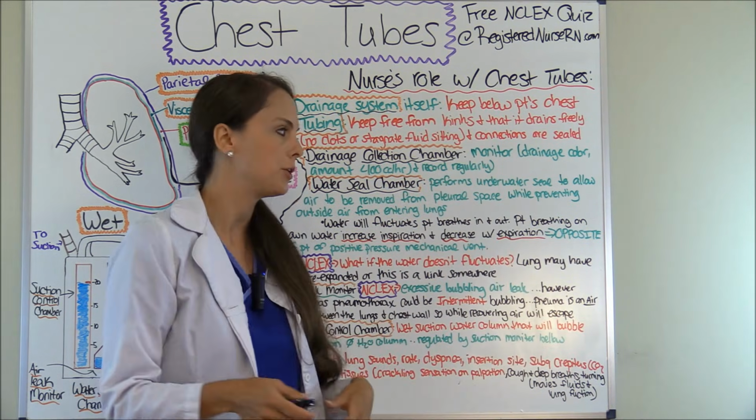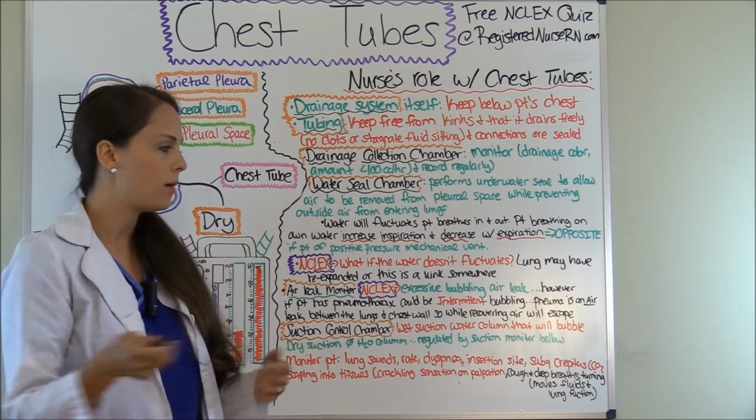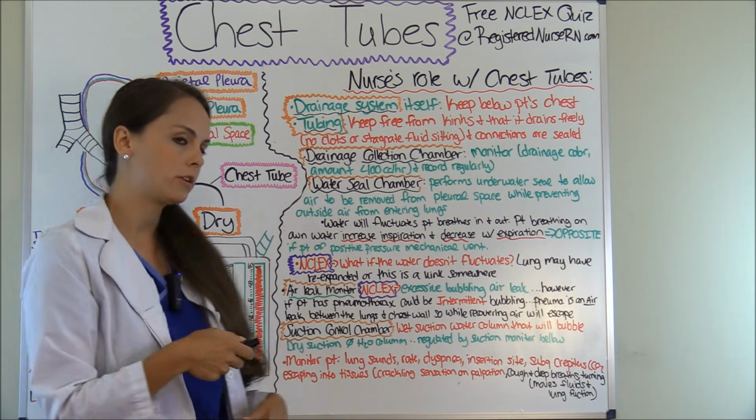What could be the issue? Well, the lung may have re-expanded, corrected our problem, or there's a kink somewhere. So you want to check that out. Next, the air leak monitor area.